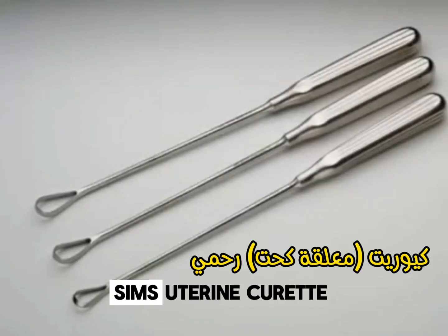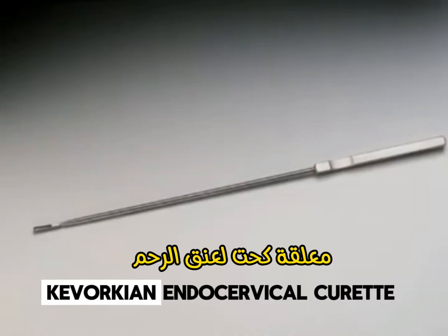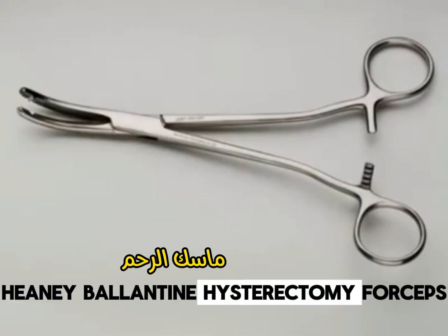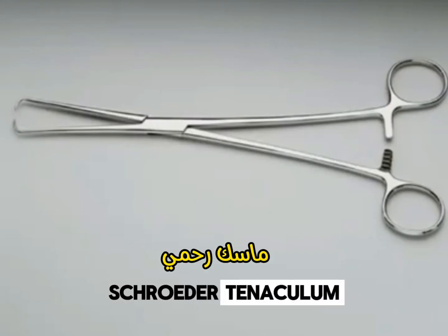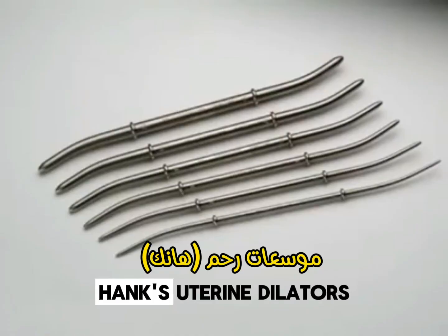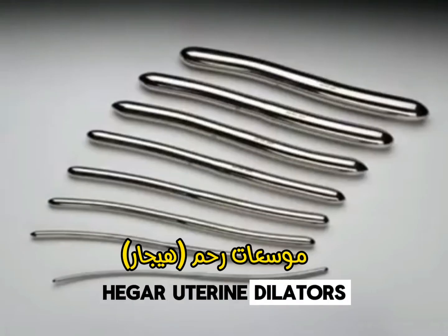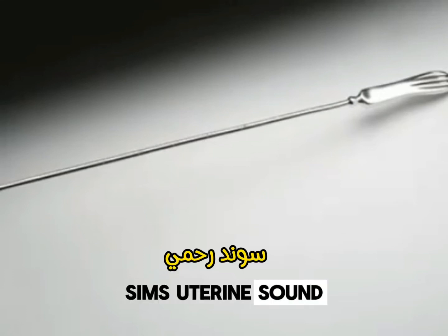Simms Uterine Curette. Kevorkian Endocervical Curette. Haney Ballantyne Hysterectomy Forceps. Schroeder Tenaculum. Hank's Uterine Dilators. Hegar Uterine Dilators. Simms Uterine Sound.